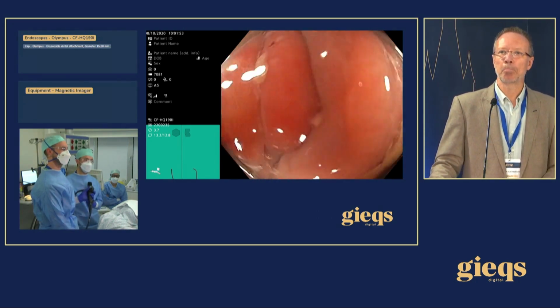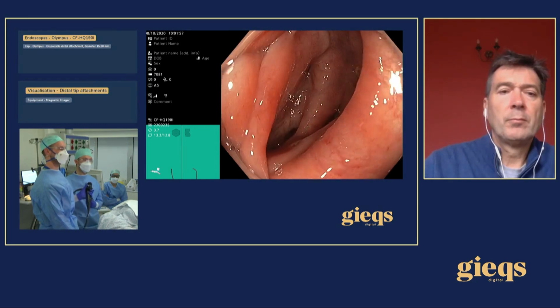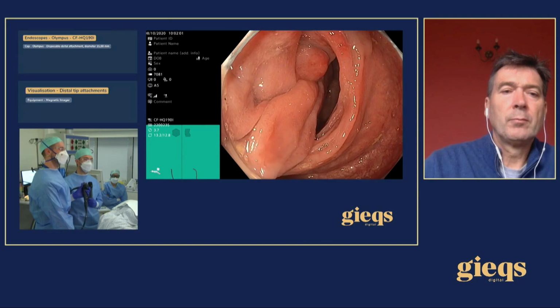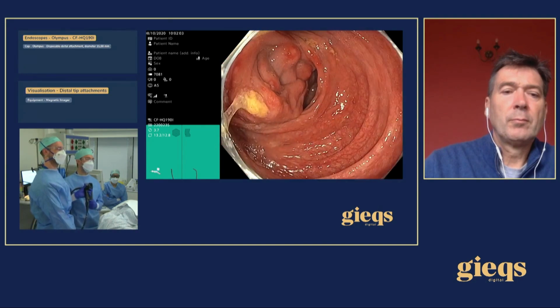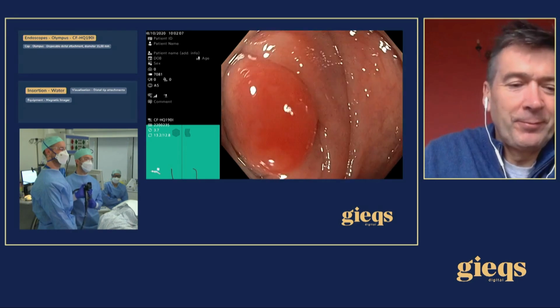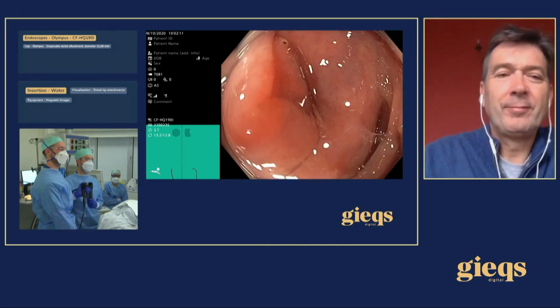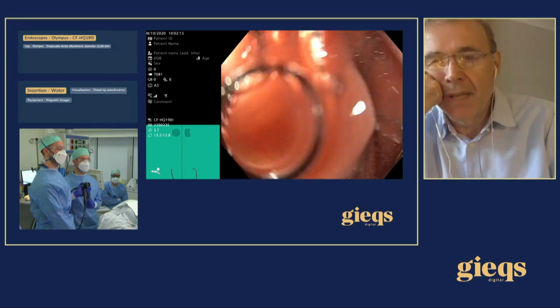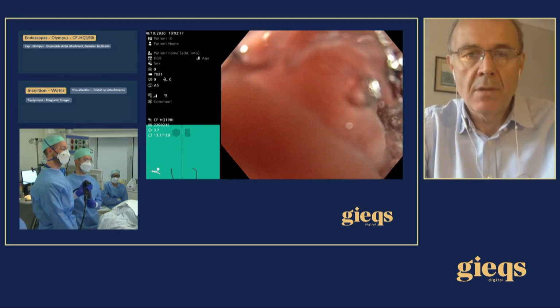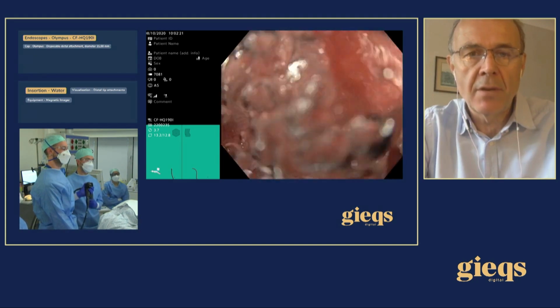I mean, the lumen looks quite narrowed. What are you thinking about the safest way to proceed? We could use some water. Yeah. What do you think, John and Roland? I'll hand this to Roland. Go on, Roland. Well, we like using water on the way in, and we like to use minimal sedation as well. So providing the view is good, which it does look very good.